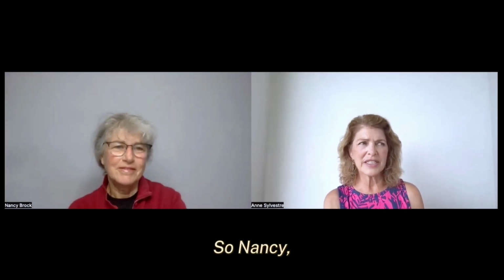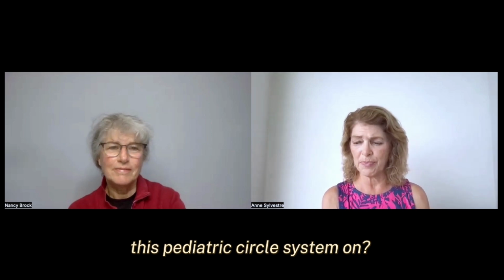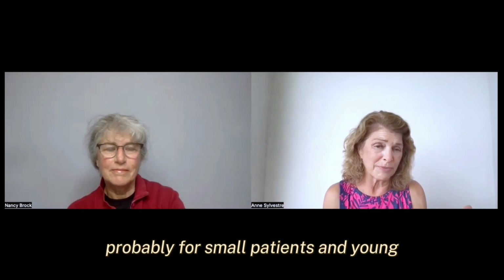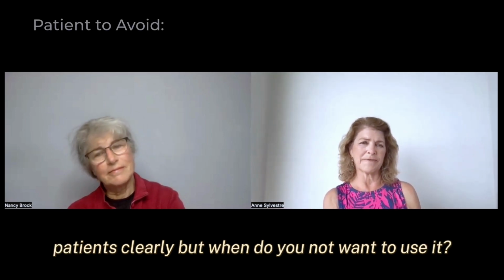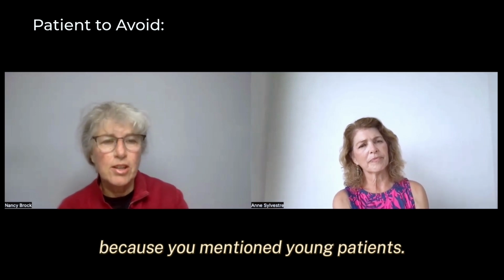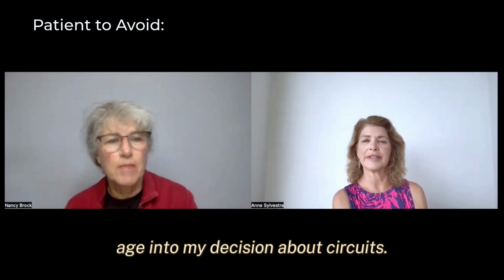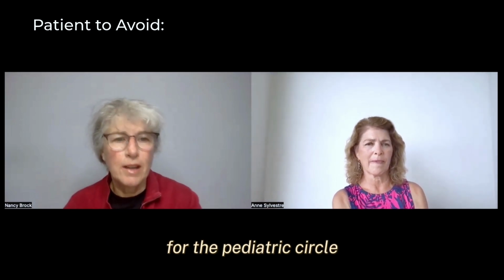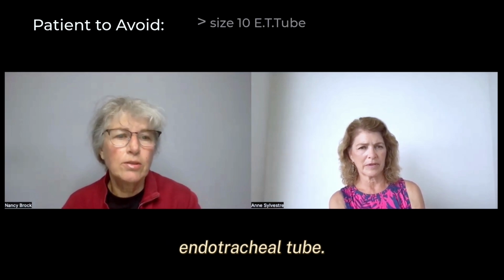So Nancy, what kind of patients would you not use this Pediatric Circle system? I mean, I'm getting it's probably for small patients and young patients, clearly, but when do you not want to use it? Well, so just a quick point about age, because you mentioned young patients. I don't typically factor patient age into my decision about circuits, but there is a patient that's going to be too big for the Pediatric Circle, and that's the patient that fits a size 10 endotracheal tube.